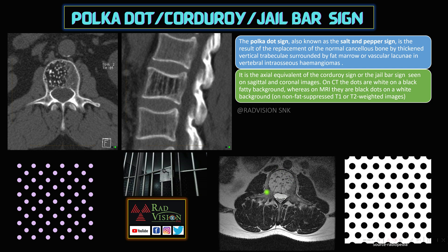On MRI, you can see the hyperintense fatty marrow and multiple prominent vertebral trabeculae depicted by hyperintense lines. This is the intraosseous hemangioma appearance on MRI. Remember: polka dot sign, corduroy sign, or jail bar sign in case of vertebral intraosseous hemangiomas.